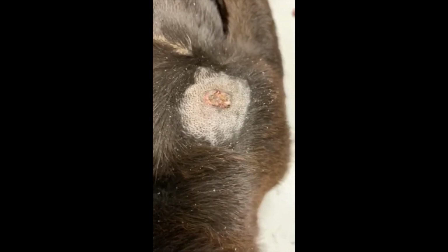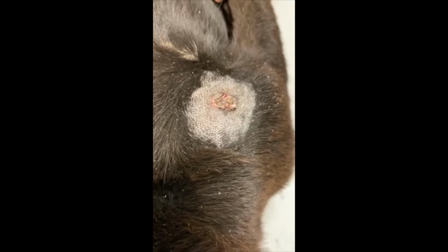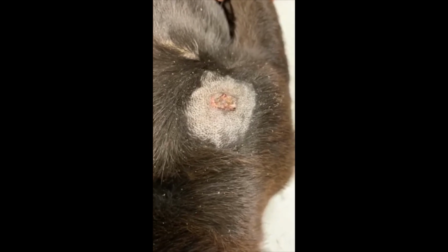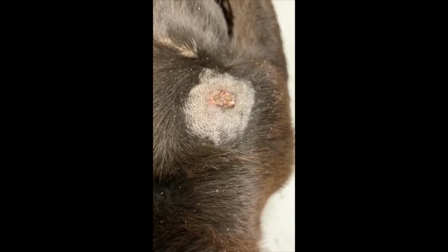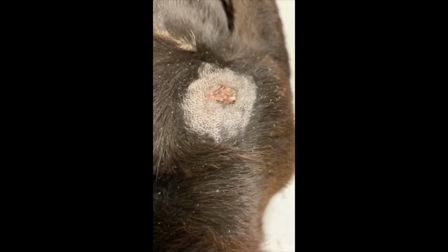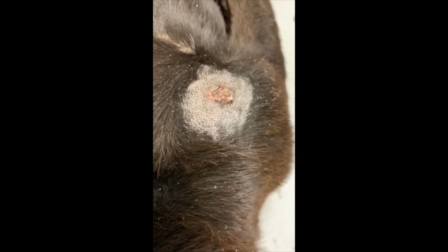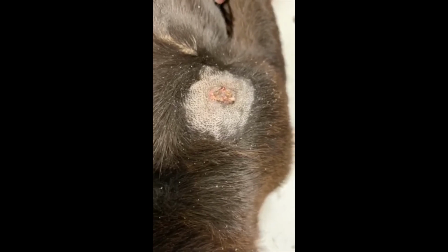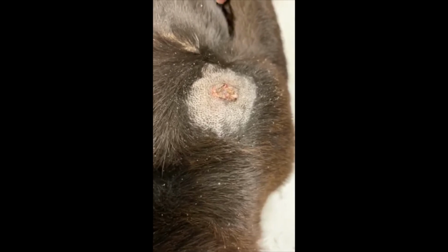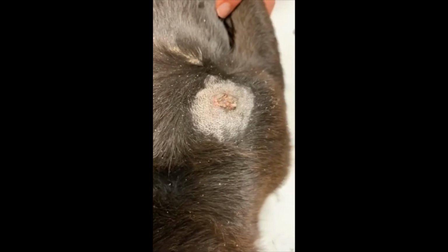So we're going to freeze this lesion. Given its broad base, we're going to use the D3 tip. We're going to freeze it 2 cycles, approximately 45 seconds each, with a thaw cycle in between, and we'll recheck it in 3 weeks. Most of these lesions will be completely resolved. In some cases where the mass or growths are extremely thick or alternatively large, we may require a follow-up treatment 3 weeks out. Again, these are typically done without anesthesia and without any type of local preparation.